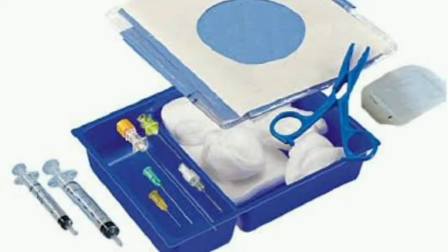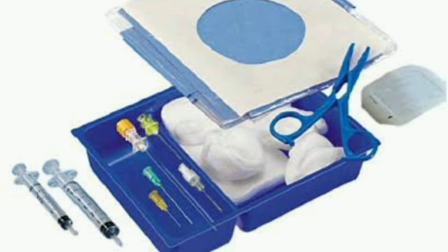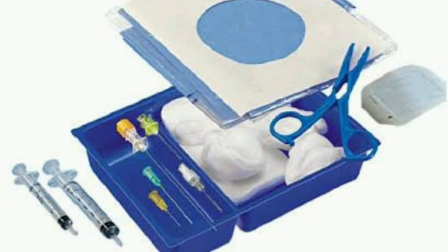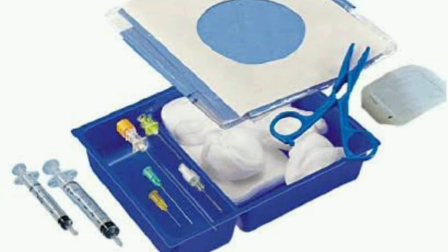As part of the preparation, discuss with the patient options for anaesthesia, explain the risks and benefits of each procedure, choose an appropriate local anaesthetic, and choose the appropriate spinal needle.